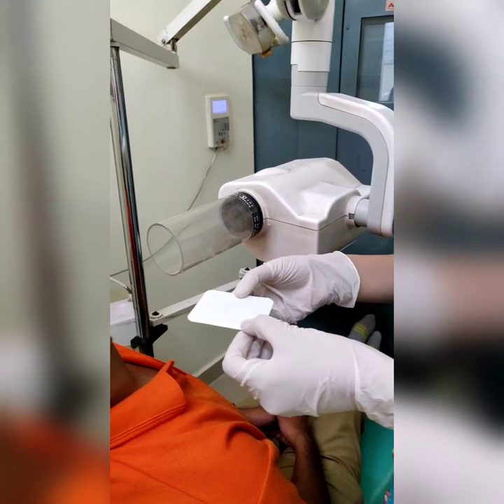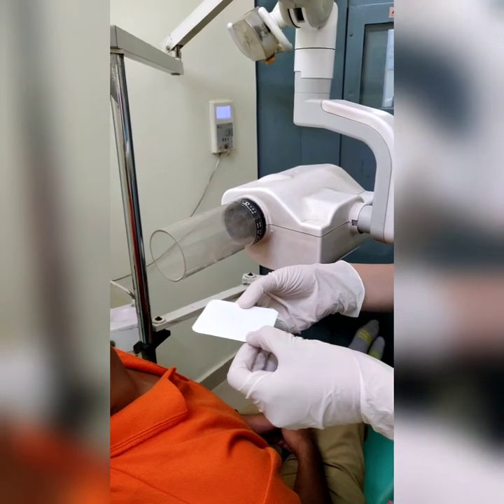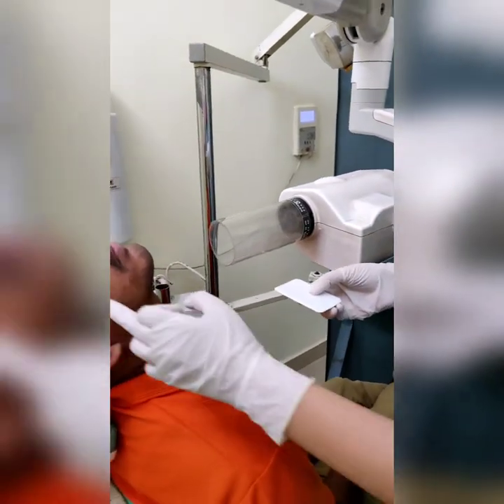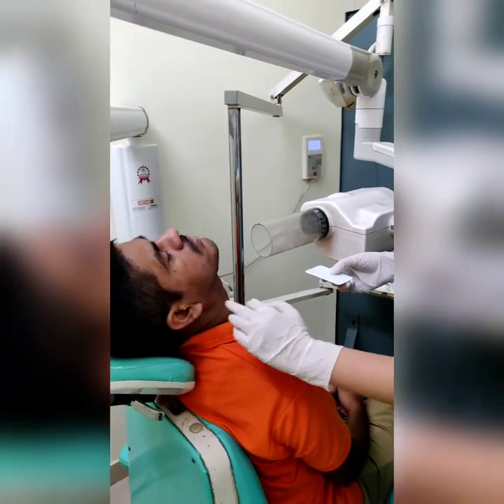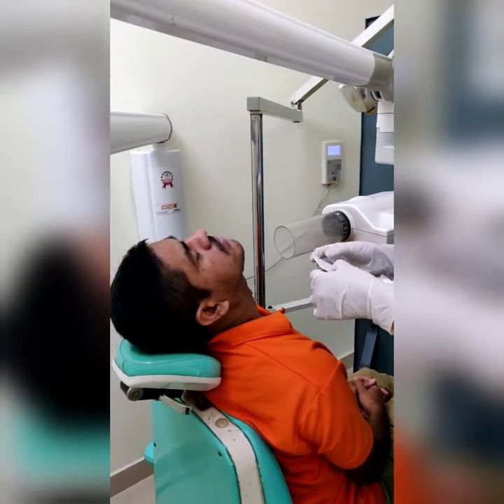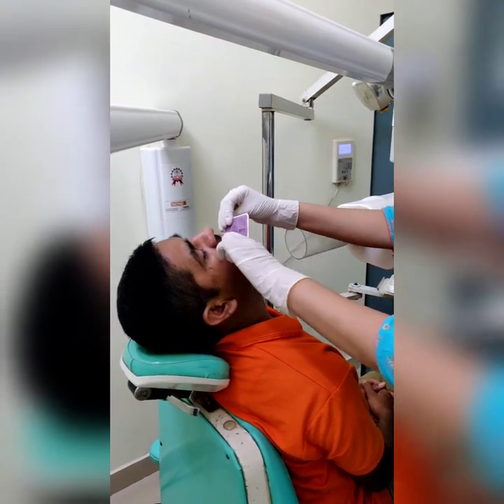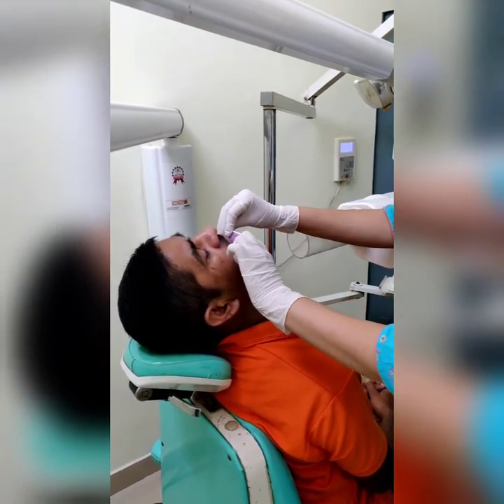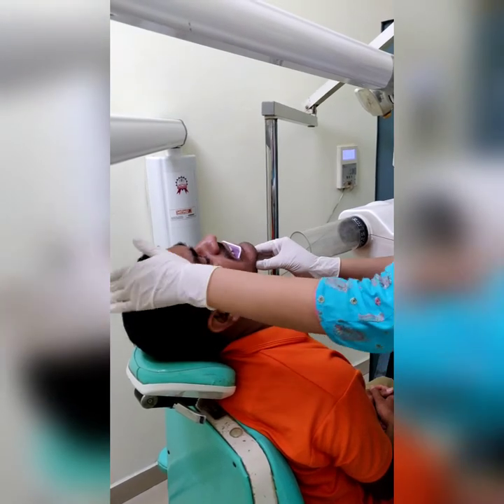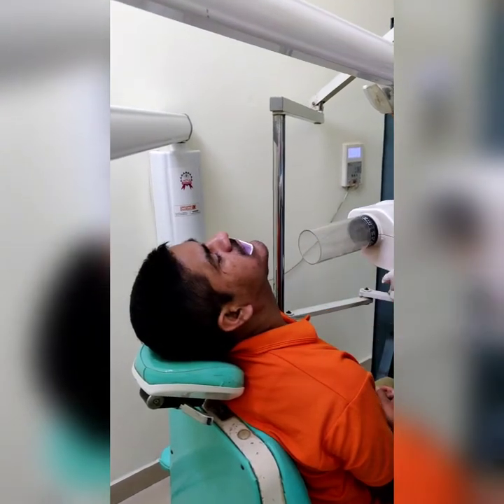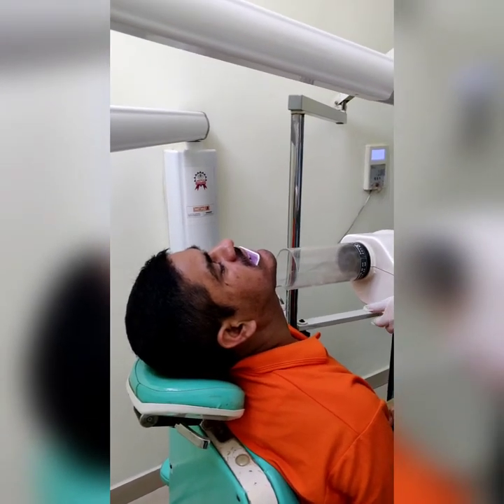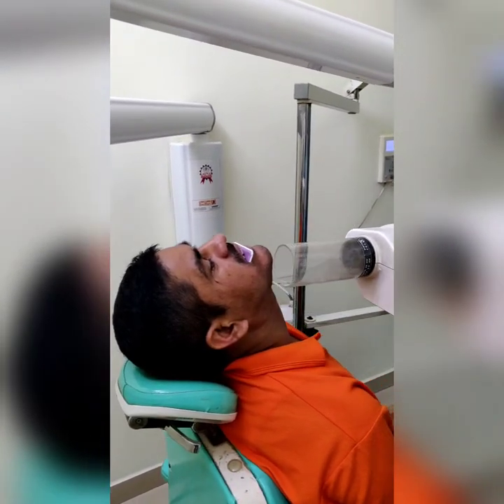For the mandibular cross-sectional occlusal radiograph, the patient's head is positioned so that the ala-tragus line is perpendicular to the floor. The occlusal film is placed with the occlusal dot directed towards the mandible. The patient is asked to slightly bite on the film, and the central ray is directed perpendicular to the film.